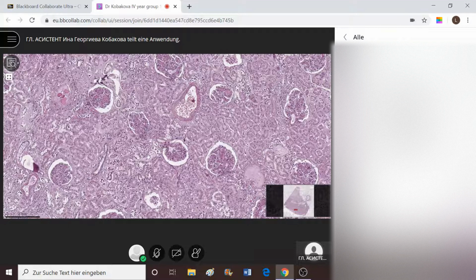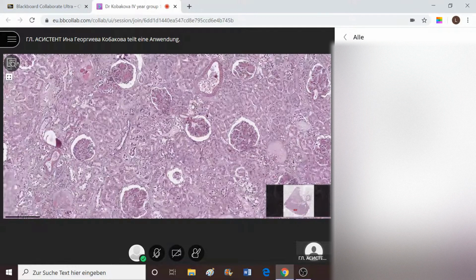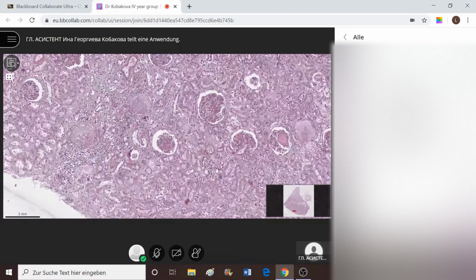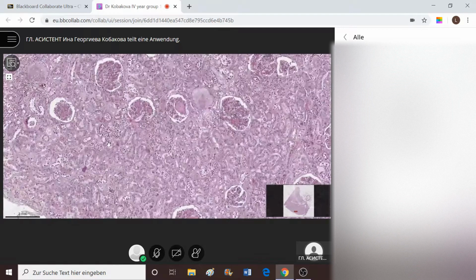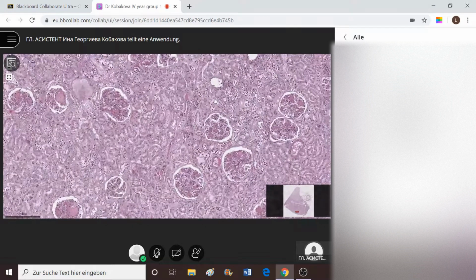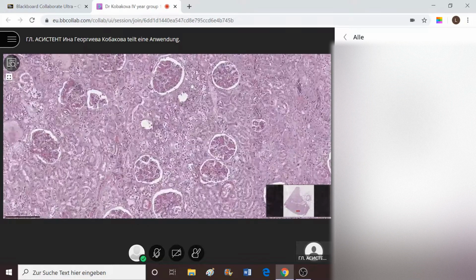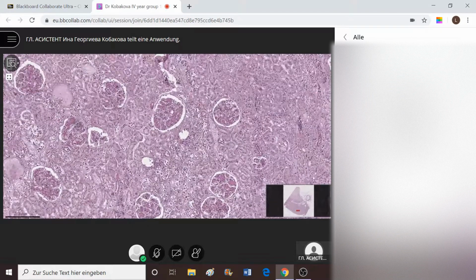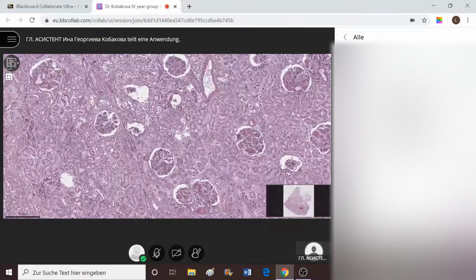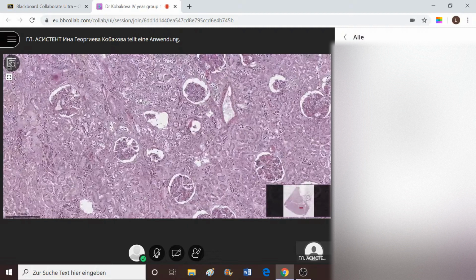So pretty much we mentioned everything that we should observe about this type of disease and how we diagnose it, depending on the look of the glomeruli. They appear pretty much normal, except for the deposition of these substances in between the capillary loops. So I think it's pretty much diagnostic like this. But anyway, you should be able to mention the stages of diabetic glomerulopathy.